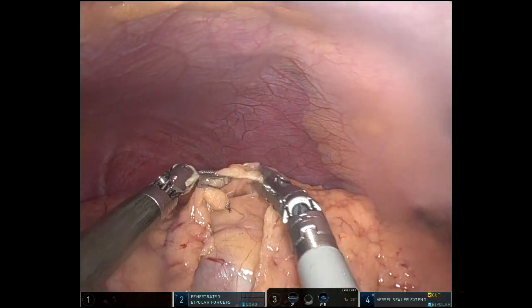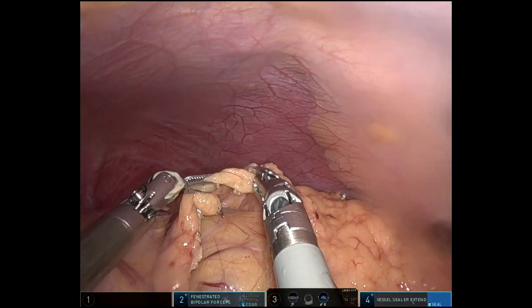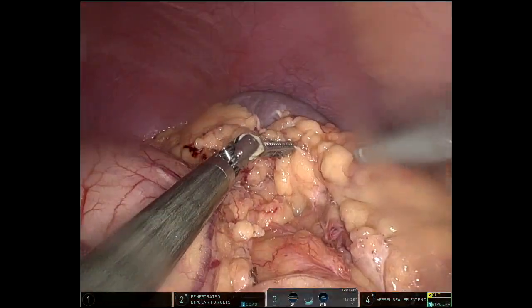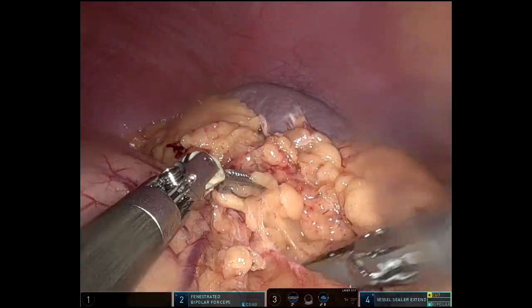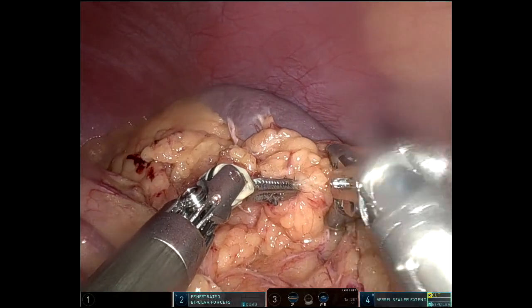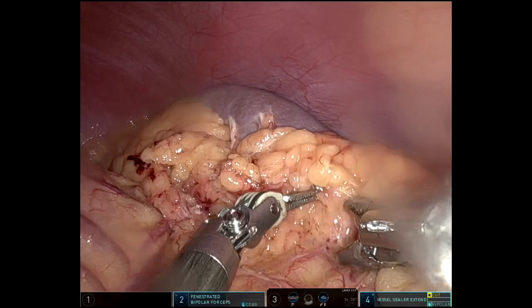Now entering through the gastrocolic ligament into the lesser sac. For this patient, I found this was the best way to mobilize the splenic flexure. She had a lot of scarring of the omentum to the spleen, as you can see, and it was challenging from laterally. So I decided to go supracolic, medial to lateral — and it worked out well.